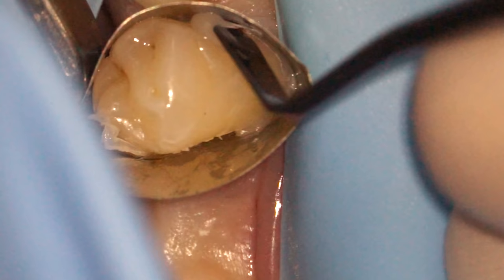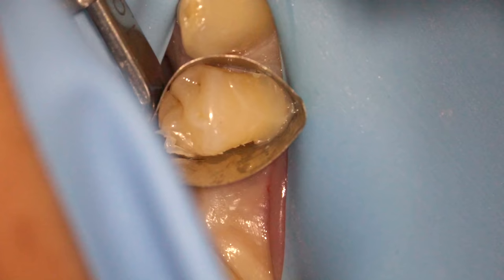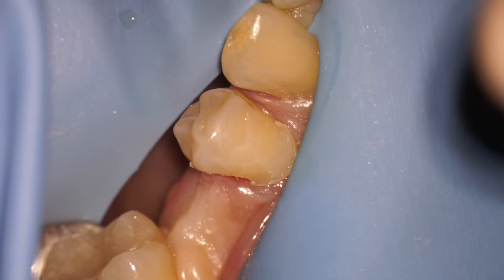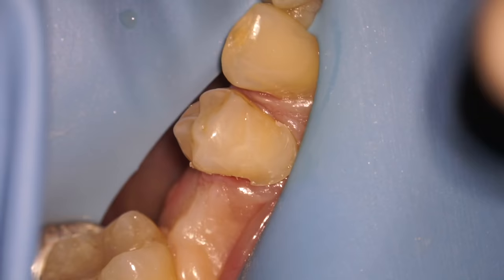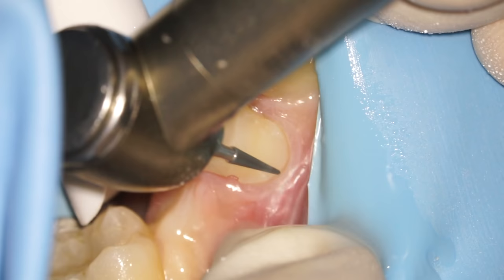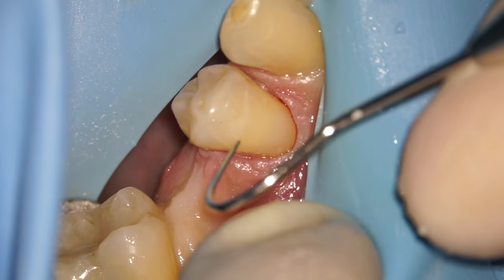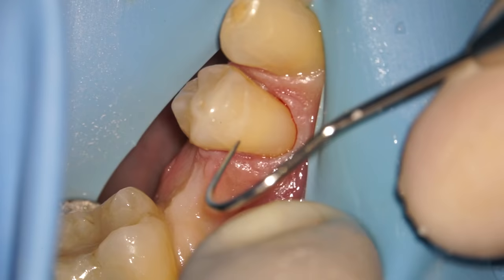Here I'm just making sure that it's well adapted to the margins of the tooth. Then we cure that and we have a rough shape to our filling, so the next step is to clean that all up. A lot of people are concerned about touching the gums in these areas — I do not worry about that at all. I actually get right underneath the gum line and make sure that the filling material is perfectly flush with the tooth.